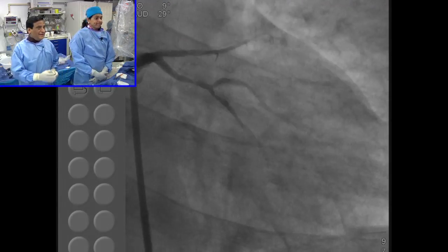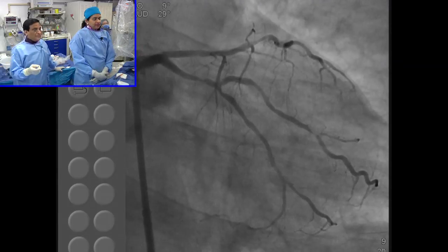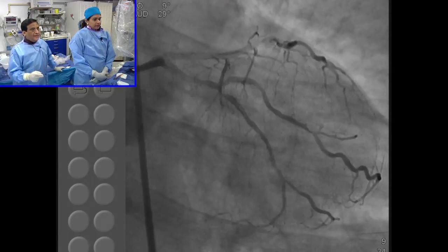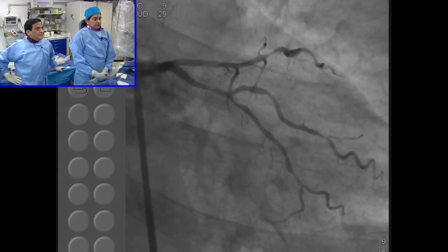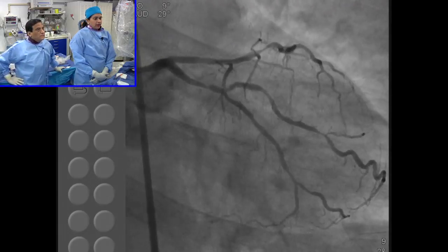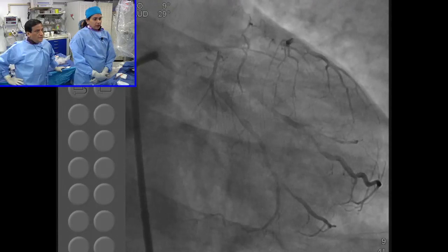Although there are many studies, I think that seems to be very good. But I don't know whether this is actually even complex, because besides your bifurcation, you have 2 additional lesions in each vessel, which you need to address first before you come to the bifurcation. But then we can only take care of the OM1. I think OM2, the distal lesion, you can just decide on medical therapy.